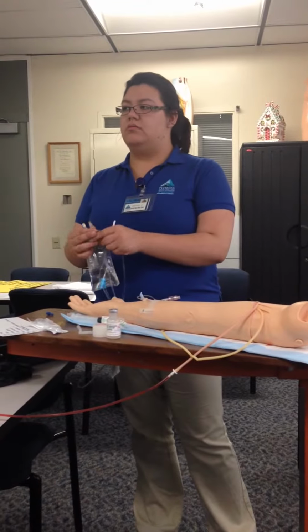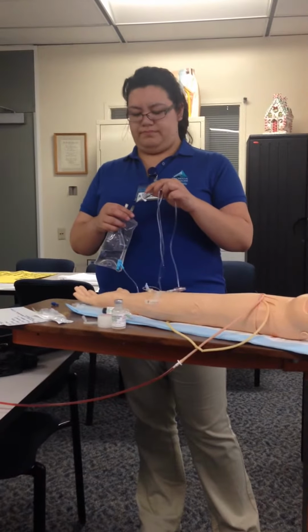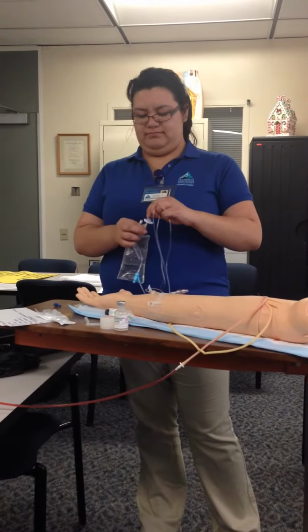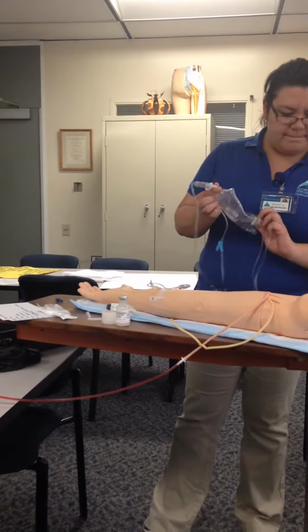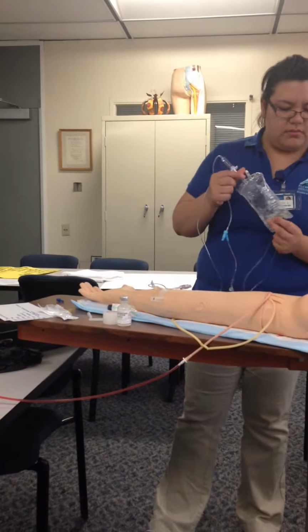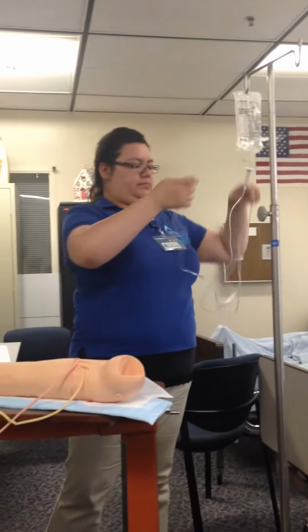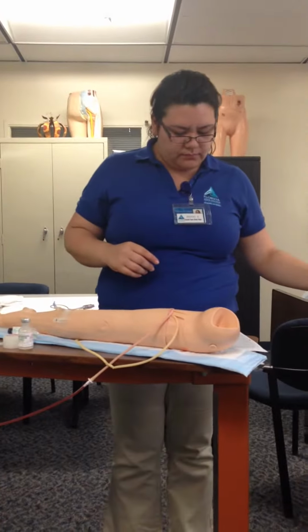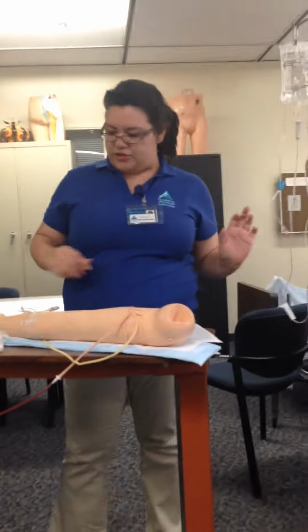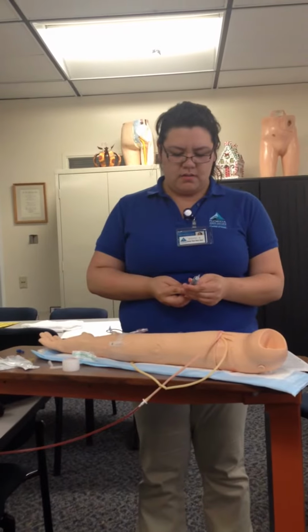Clean with alcohol. Okay. I'm going to draw up 6 mLs of saline.